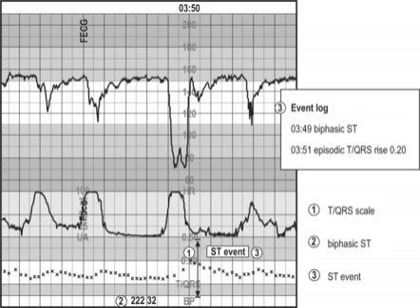When we started this discussion, we were talking about identifying the at-risk fetuses so that we could intervene. Over the years, fetal hypoxia became the working hypothesis as to what was causing these injuries, and all the approaches were aimed at detecting this decreased fetal oxygenation. At first, we tried to identify the fetal heart rate patterns associated with fetal hypoxia, with, as we have discussed, limited success. In order to remove a level of abstraction, we added fetal scalp pH, which is still a surrogate for fetal oxygenation because as fetal O2 falls and CO2 rises, the pH falls.